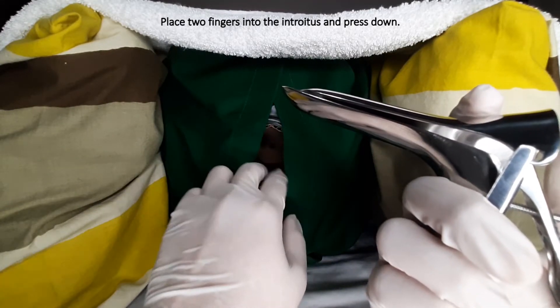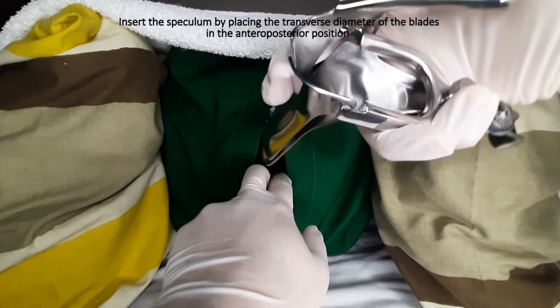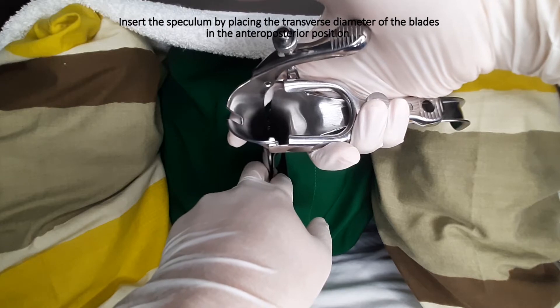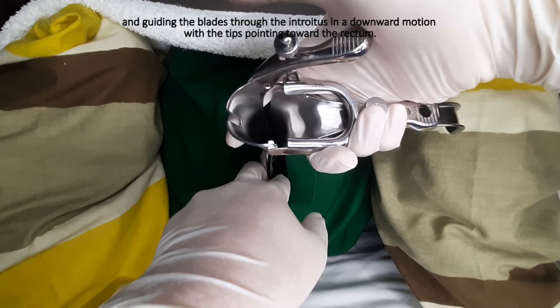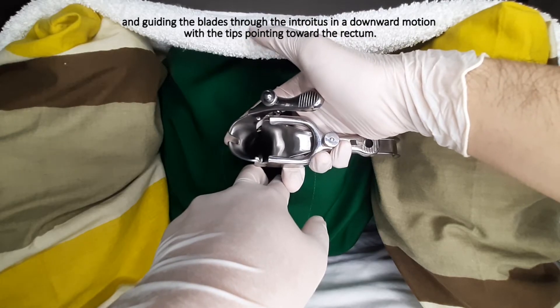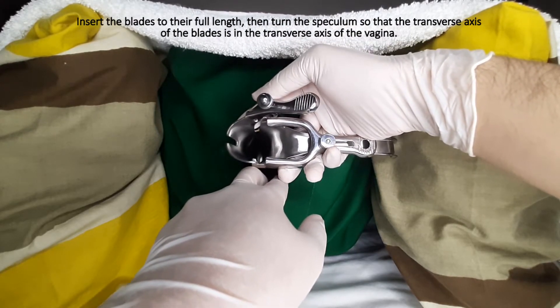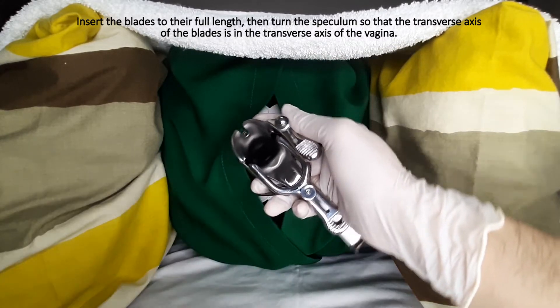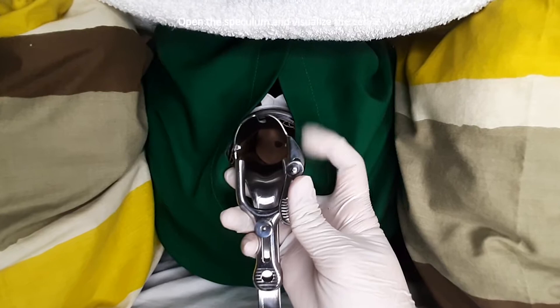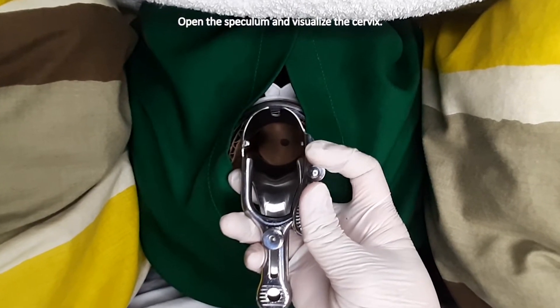Place two fingers in the introitus and press down. Insert the speculum by placing the transverse diameter of the blades in the anterior-posterior position and guiding the blades through the introitus in a downward motion with the tips pointing toward the rectum. Insert the blades to their full length, then turn the speculum so that the transverse axis of the blades is in the transverse axis of the vagina.